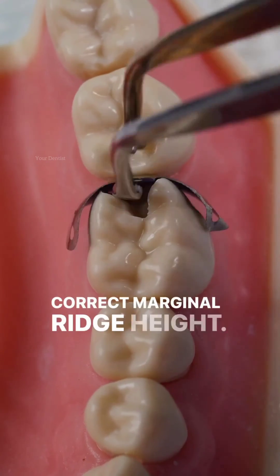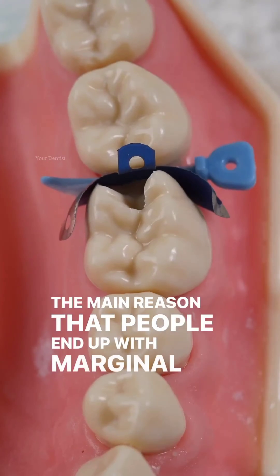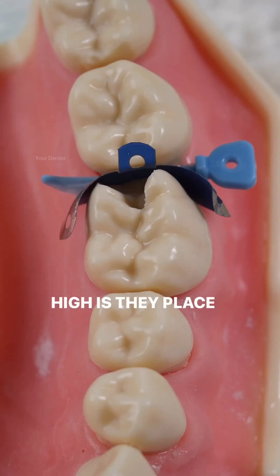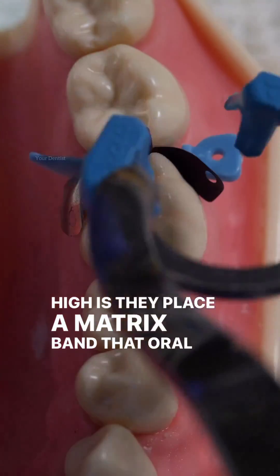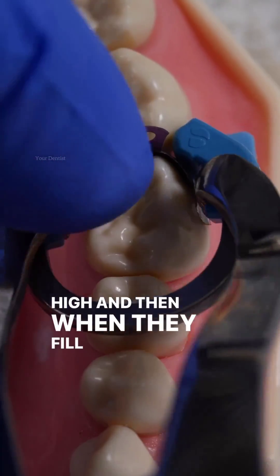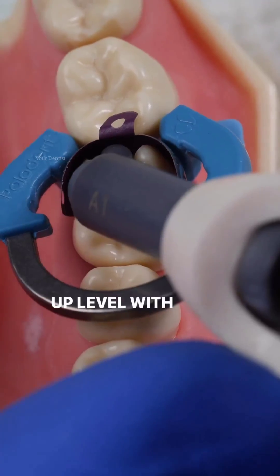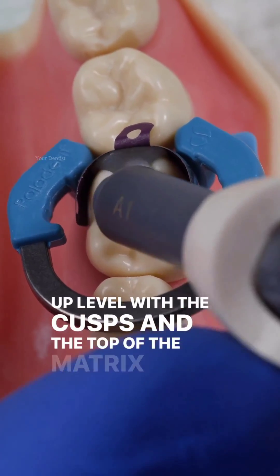Correct marginal ridge height. The main reason that people end up with marginal ridges too high is they place a matrix band that is too high, and then when they fill the cavity they fill it up level with the cusps and the top of the matrix band.